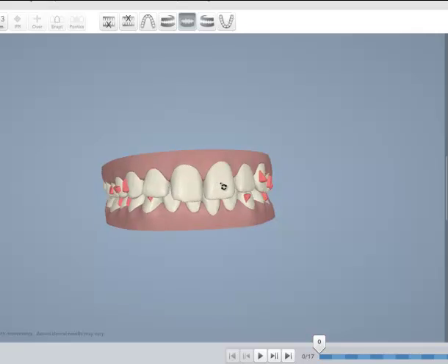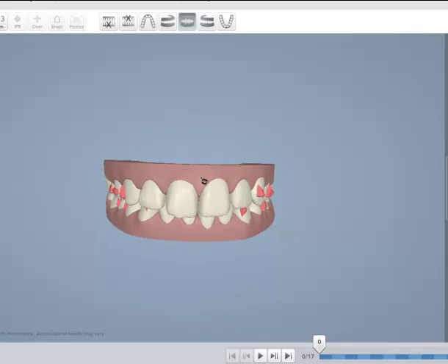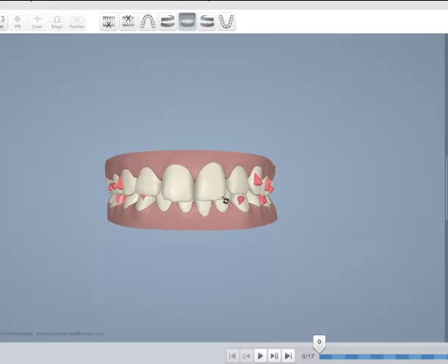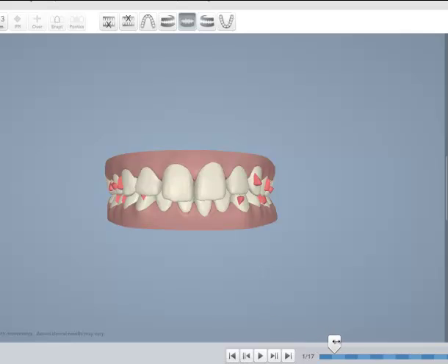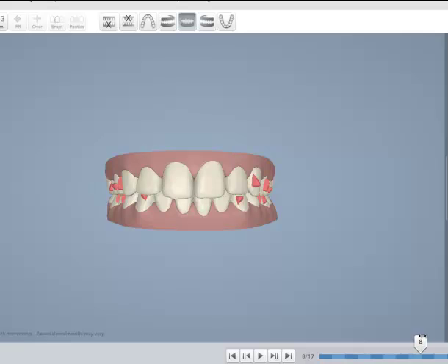This case really doesn't present a high amount of difficulty. Let's see what ClinCheck has done for us. You can see now we've asked to intrude the incisors, and by intrusion you're going to consume some space already.